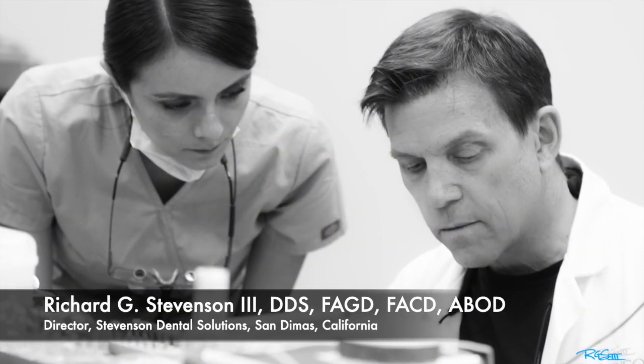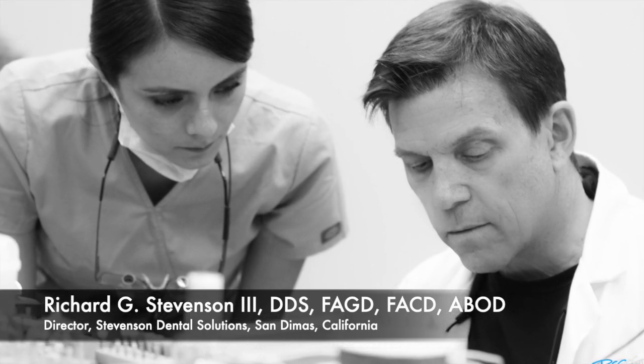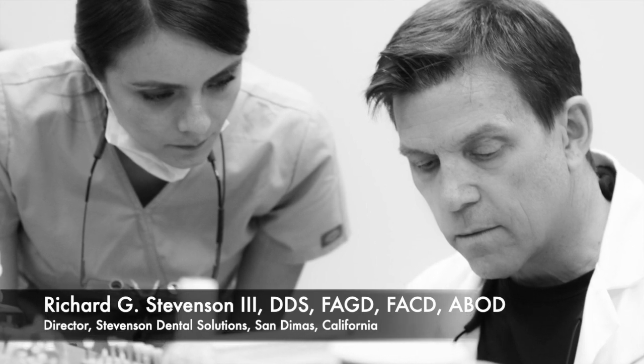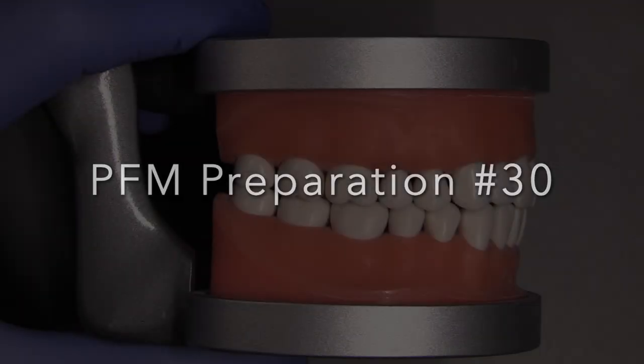Hi everybody, I'm Dr. Richard Stevenson and I'm the director of Stevenson Dental Solutions in San Dimas, California. We are a hands-on teaching center that focuses on excellence, and today we are going to discuss the PFM on tooth number 30.